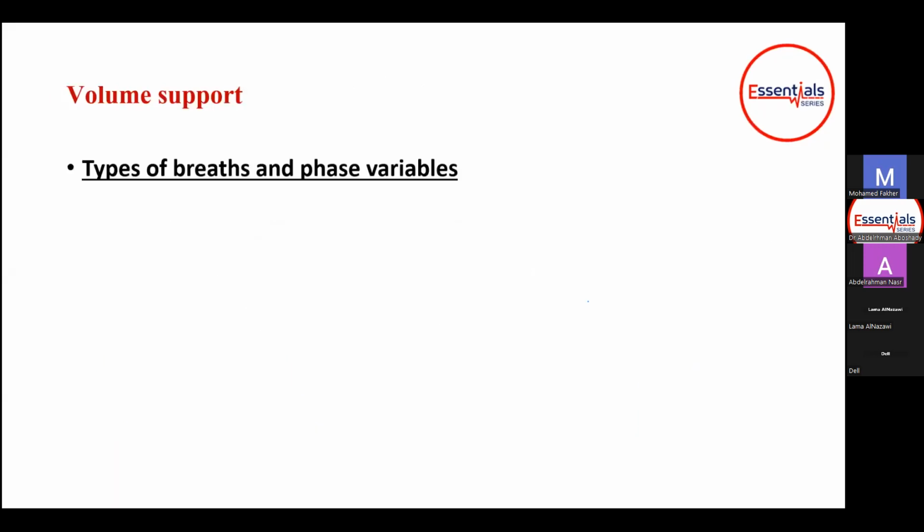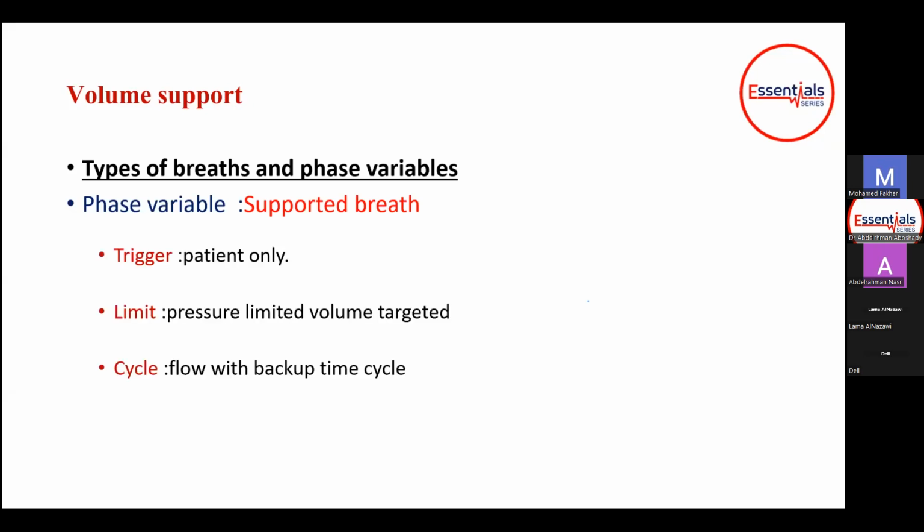Types of breaths delivered by the volume support mode are only supported breaths triggered by the patient and pressure limited, yet this pressure limit is not fixed. It changes up and down to achieve the tidal volume you need. Cycling is flow cycled like any supported breath.